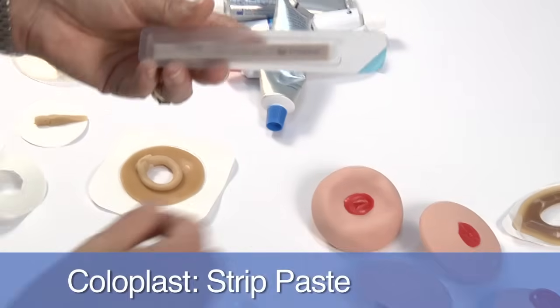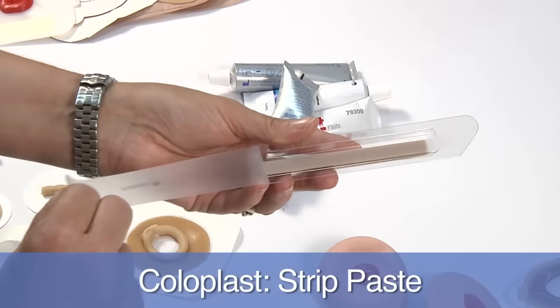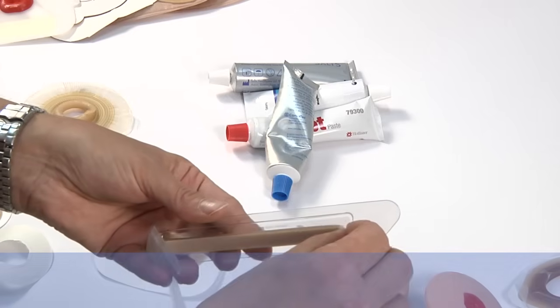The next grouping is Strippaste, and probably the most commonly known is this one from Coloplast. Hollister also has a Strippaste.